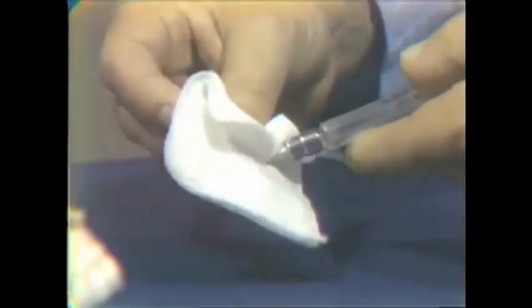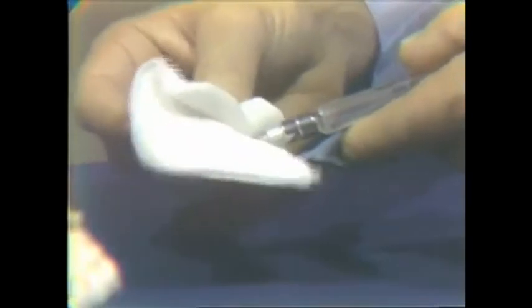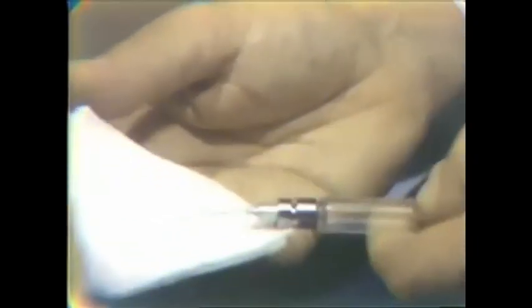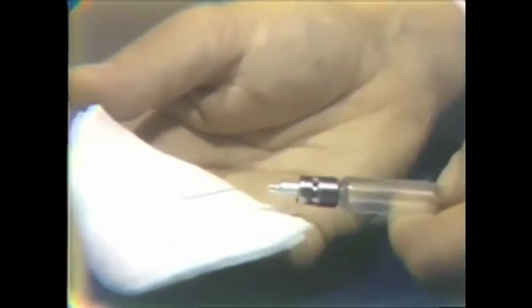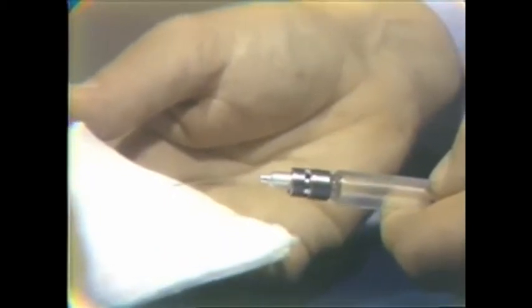And I just give it a little twist here. These steel needles are a little passive so that you can get a curve in them. I don't know whether you can see that or not, but you can see that our needle is curved. And this allows us to stay closer to bone as we approach the posterior superior alveolar foramina.